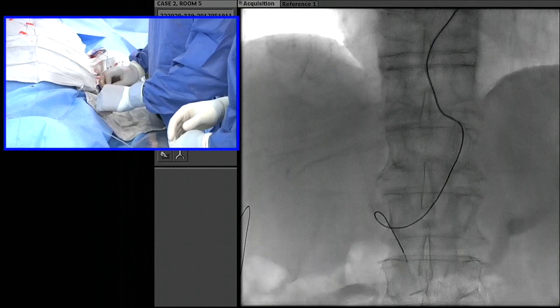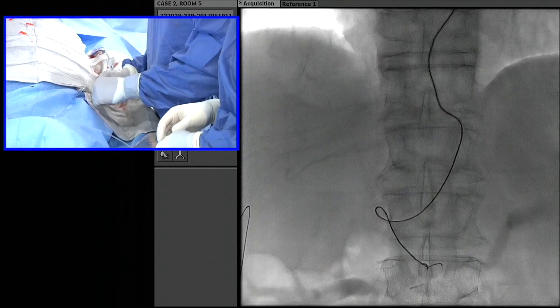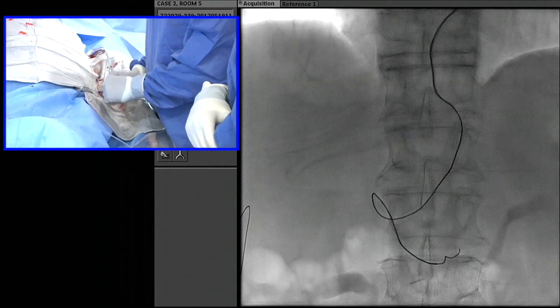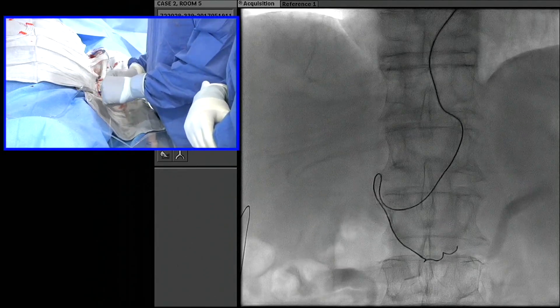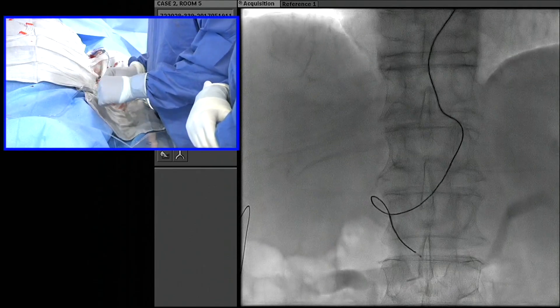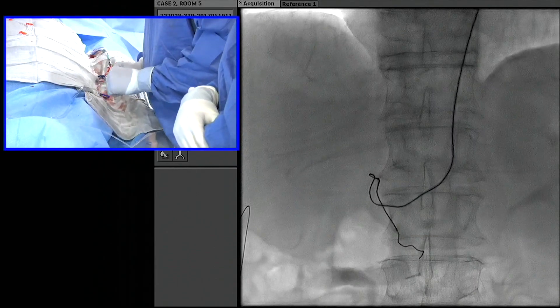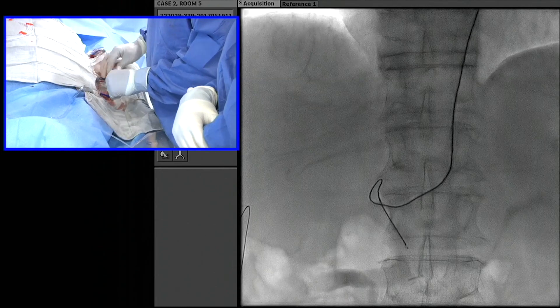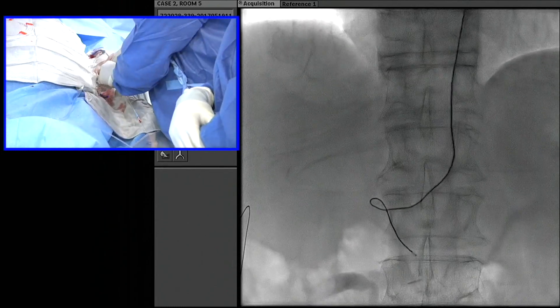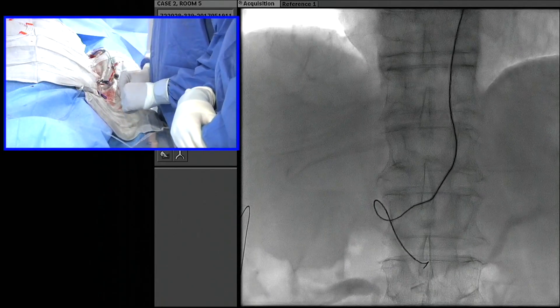Let's see if I can get this to work. This may not actually work. I'm going to try to anchor it a little further out, but it's going to just prolapse me — I think this thing's too stiff. It was a good idea, but it's not going to go. I think it's probably too big; it was sort of a push anyway to try to get this POD to form in here.